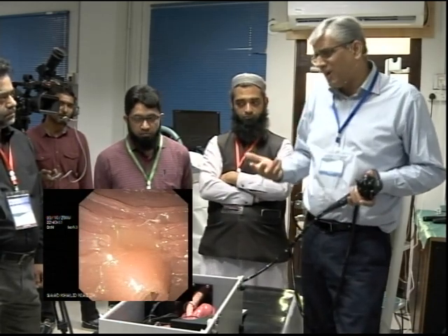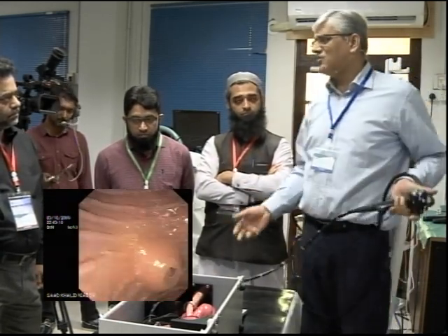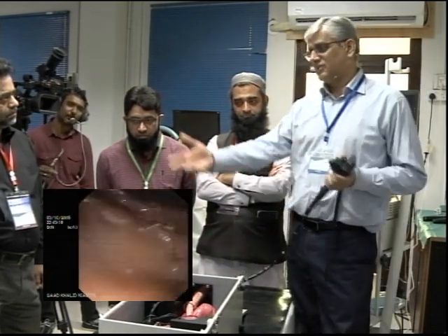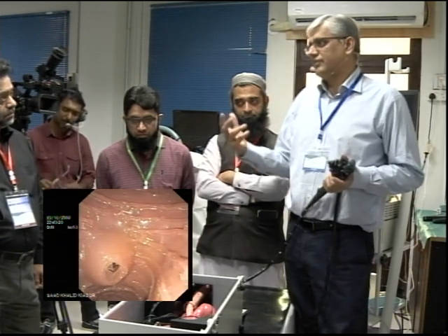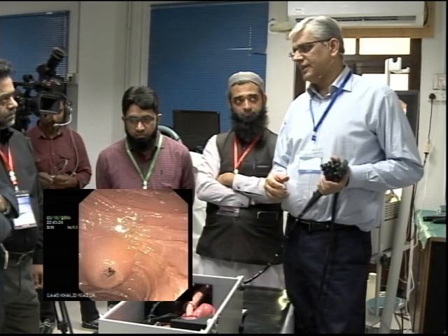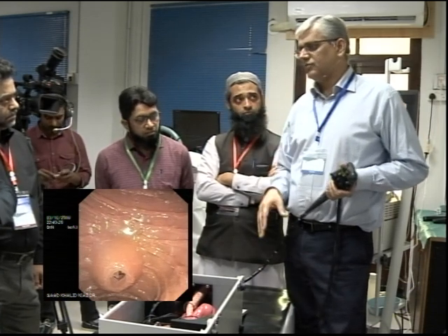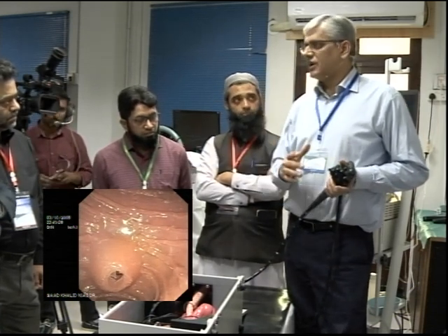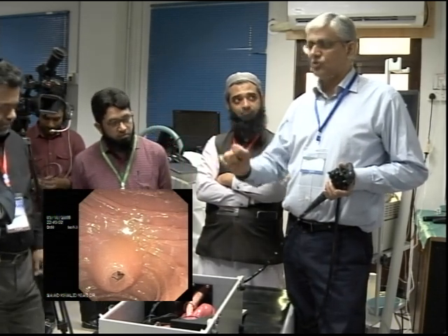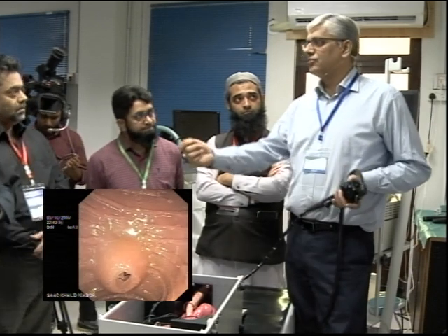So once it becomes part of the way you do it, then you're not bothered. The moment you give me the scope, I know what is happening. I'll just do a couple of maneuvers and we are back, and you think, oh, we are very good. It's just simple. Okay? Personally, like Vakas said, I totally agree with him, but in the early days, if you are uncomfortable, lock it, there is no harm. But please make sure that the locks are released before you pull the scope out.